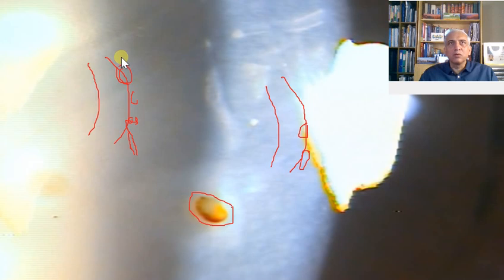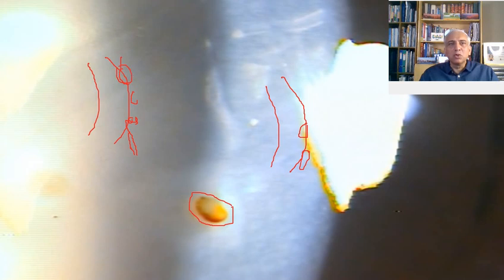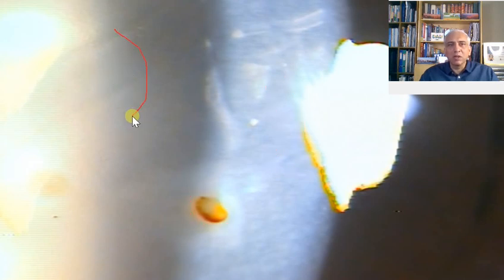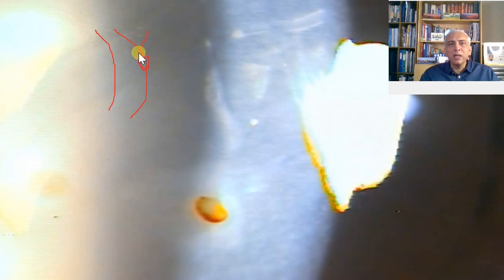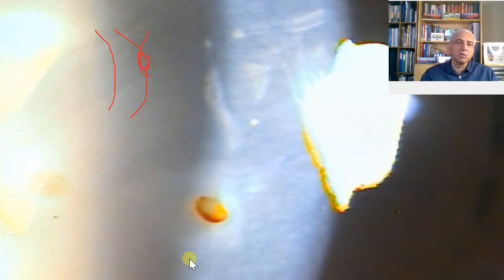Sometimes if you put your needle over here, you're going to leave the rust ring behind. So what you want to do in patients who've got a rust ring - if this is the corneal foreign body and this is the rust ring around it, you want that needle to go behind that thing. So you need to make a slight excavation to remove that foreign body.